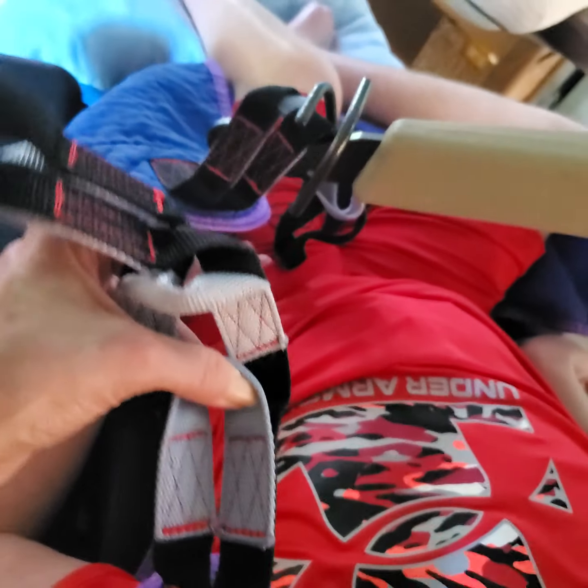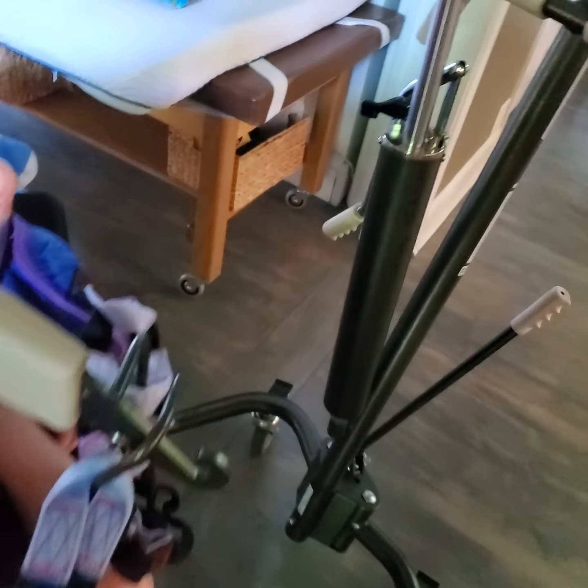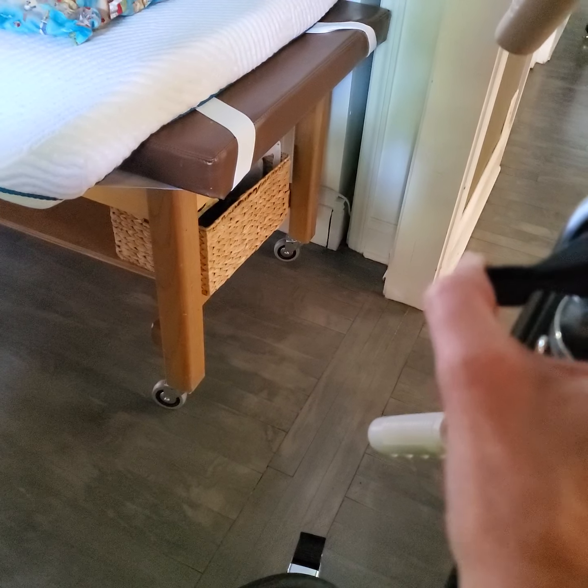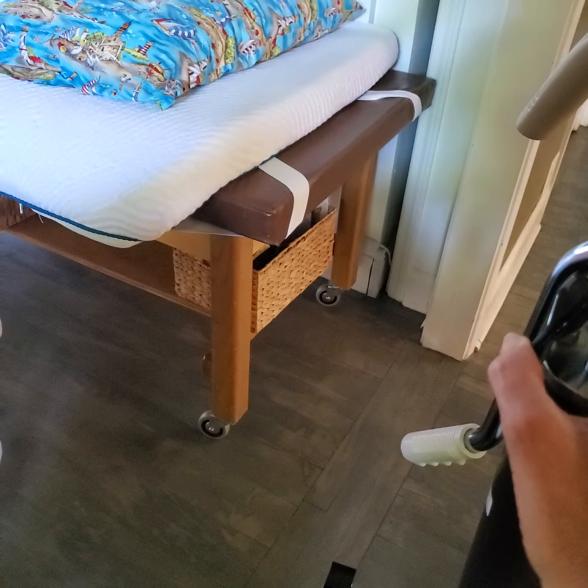Here at the bottom, I am picking the second loop and putting it on the hook that is facing him. And then I am picking up the top part and getting the first loop to hook up towards him. And you can see it's not quite reaching. So I'm going to go over to my lift and take this black button and push it to the left, towards the pole. What that does is it makes the Hoyer go down, and then I'm going to lock it back again by pushing it back. So I come over here to Jack, take my loop and my sling, and I'm able to hook it in like that.